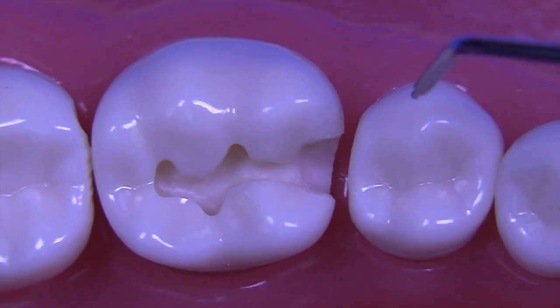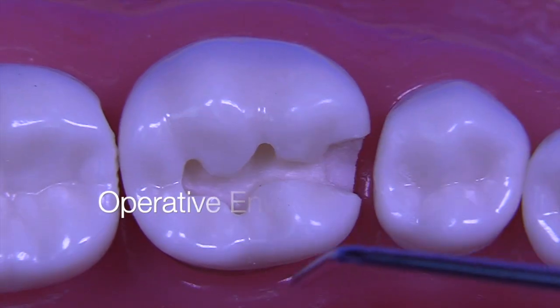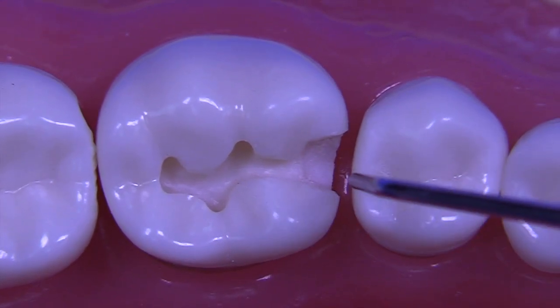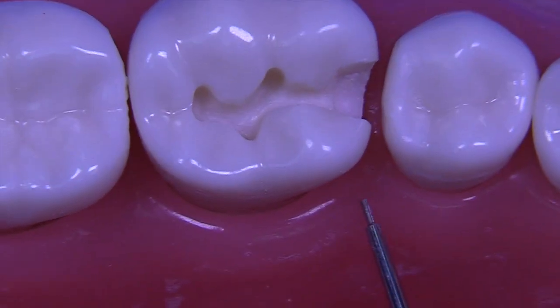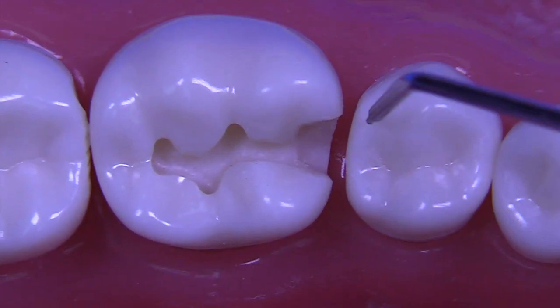The final area of evaluation is going to be the operative environment. And for that, I'm going to give 20% of your grade in that area. You can see that there's been a little bit of nicking of the adjacent tooth, but it looks like you polished it and you improved it, and that is acceptable. I don't see any marks on the tissue. I don't see any areas where you scarred the gingiva.